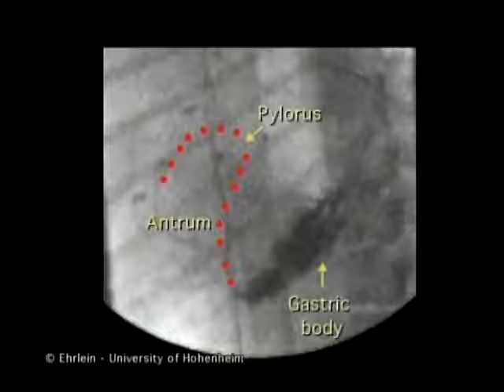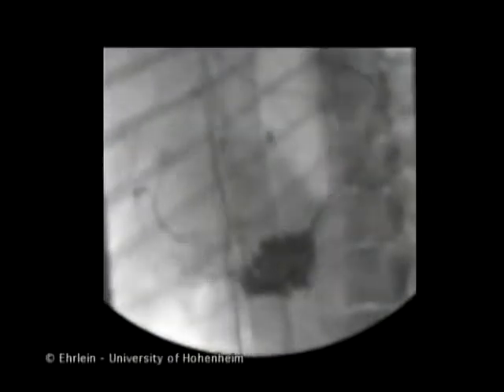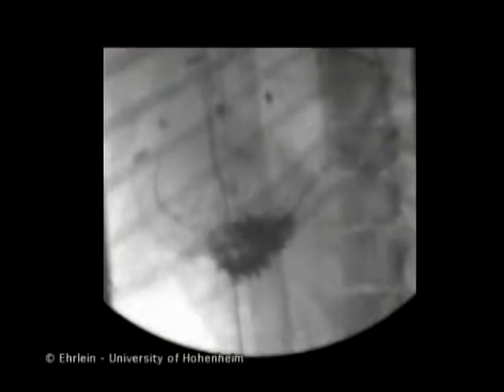Small amounts of contrast medium were again administered into the stomach at the beginning of phase 3. These accumulate in the gastric body. A tonic contraction of the gastric reservoir associated with a forceful peristaltic wave of the gastric body propels the contrast medium distally. These forceful contractions act as a housekeeper that cleans the stomach completely of residues of chyme and secretions.